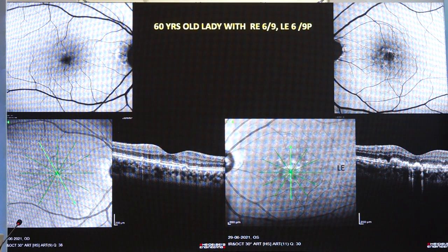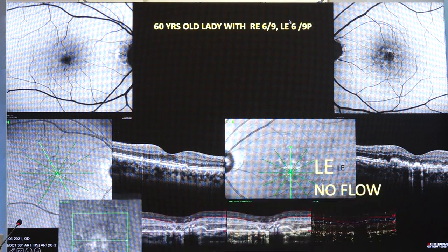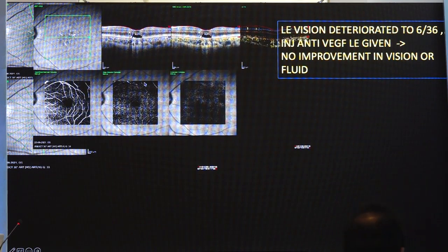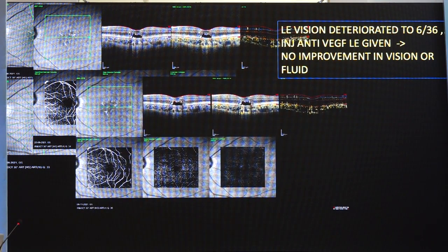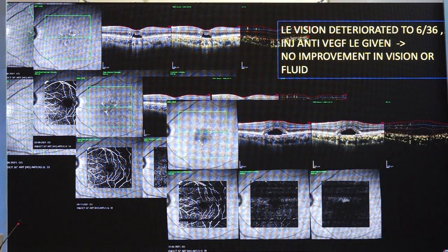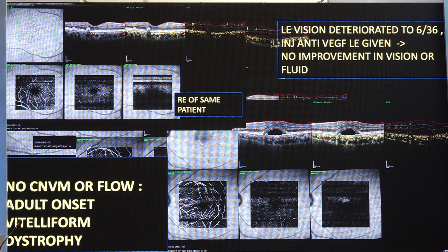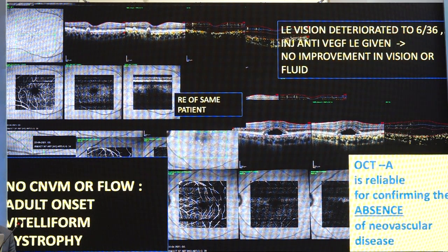This is an interesting patient — a lady who had 6/9 partial vision in the left eye with some abnormality in the RPE. On OCT angiography there was no flow. On subsequent examination this patient complained of blurring of vision and there was a hyper-reflective space developing that was progressive. Since the vision was deteriorating and there was an increase in this hyper-reflective space, it was interpreted as fluid and this patient was treated with injections, but it did not improve. OCT angiography revealed that there was no flow — this was actually a patient of adult-onset vitelliform dystrophy which had been interpreted as macular neovascularization. So OCTA is a reliable tool for confirming the absence of neovascular disease also.